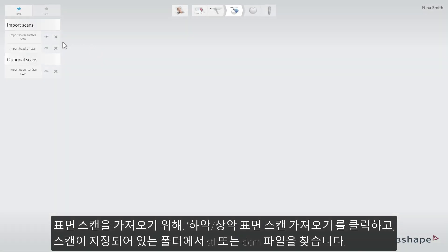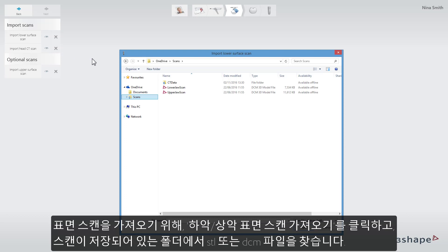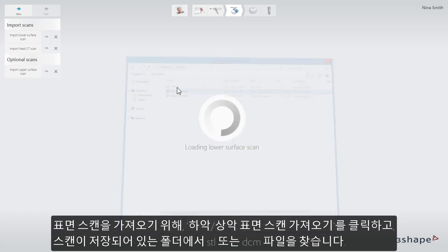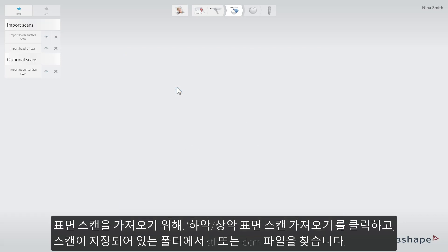To import surface scans, click Import Lower Upper Surface Scan and find the correct STL or 3-shape DCM file in the folder where the scans have been saved.